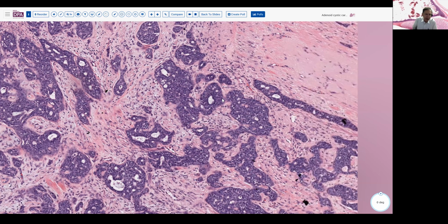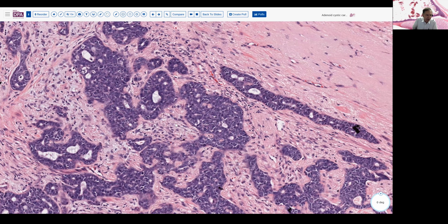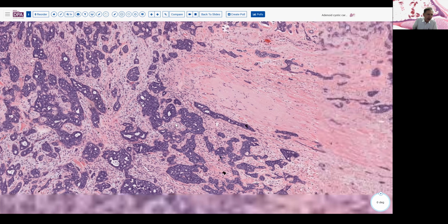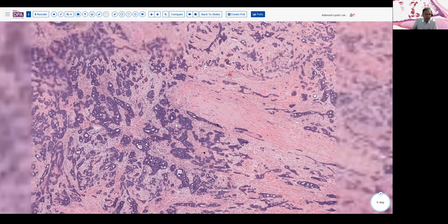One is this pattern of microcystic spaces and occasionally little eosinophilic tubular structures, which should suggest similar tumors that arise in the salivary glands, and occasionally in other locations, occasionally in the breast, occasionally in the lung.